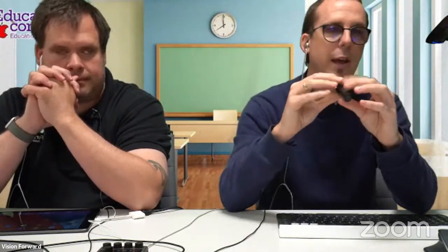It's very good at doing that, but you can get it with other features as well: facial recognition, color identification, product recognition, money identification. So it can do other things as well, but it does OCR the best out of all. I think it's the primary function. Yes. So they have two main configurations of this.